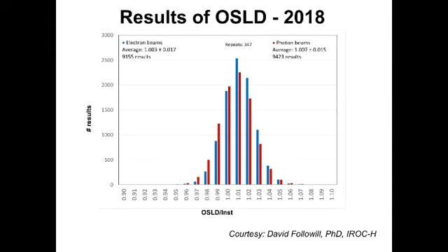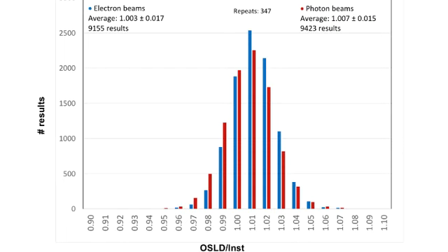You'll see that they measured over 18,000 beams in that year and measured the outputs of those beams with the system I just showed. And on average, the beams center close to 1. The output is what it should be, but you'll see that there are some outliers. And so this underscores the importance of an external audit like this.